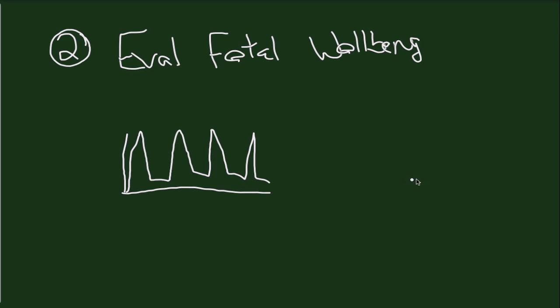An abnormal waveform shows increased blood flow to the middle cerebral artery during diastolic blood flow. So as here, this is systole, that's the peak systolic velocity, and here's diastole.